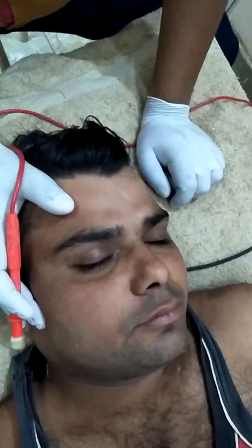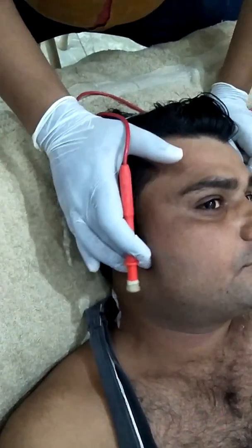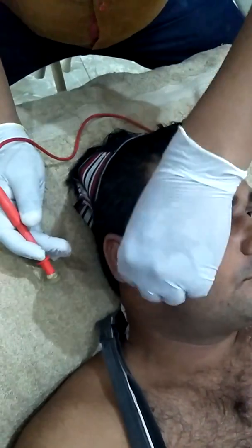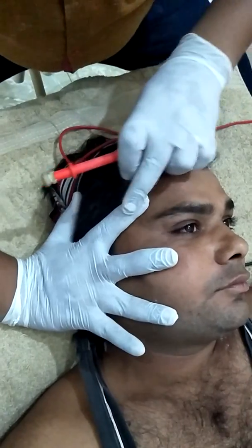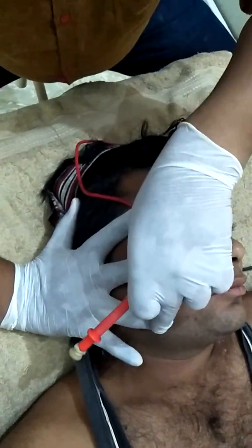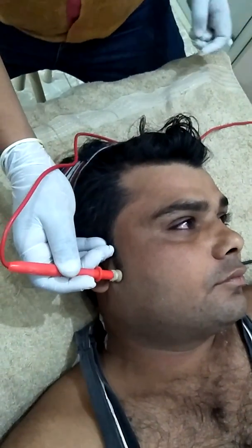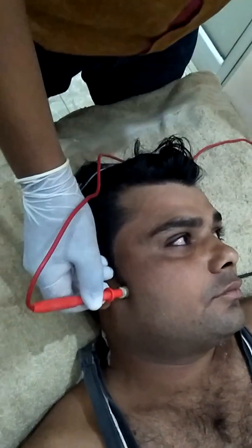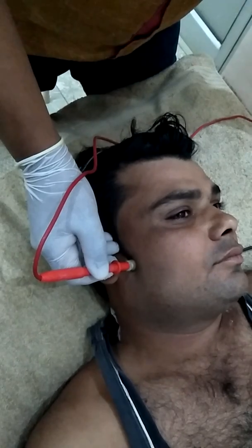These are muscles of the facial nerve. This is the root of the facial, seventh cranial nerve, which supplies in three branches like this: mentalis, zygomatic, and frontalis. When we apply the stimulation at the root area of this nerve, we can see both movements like this.